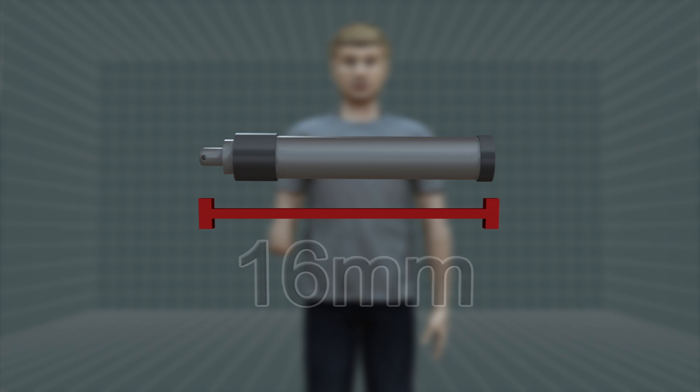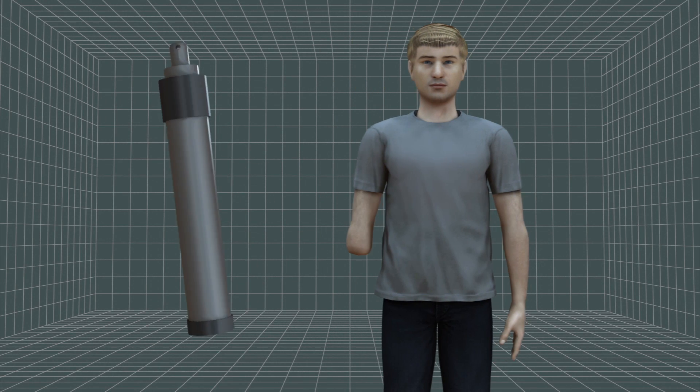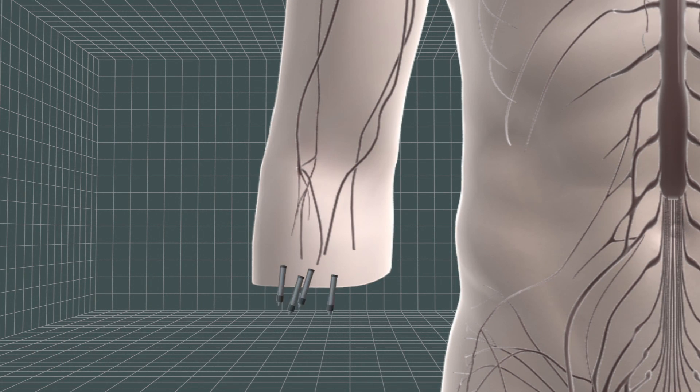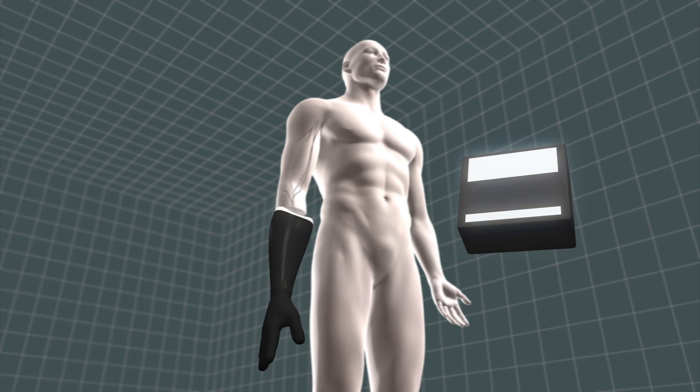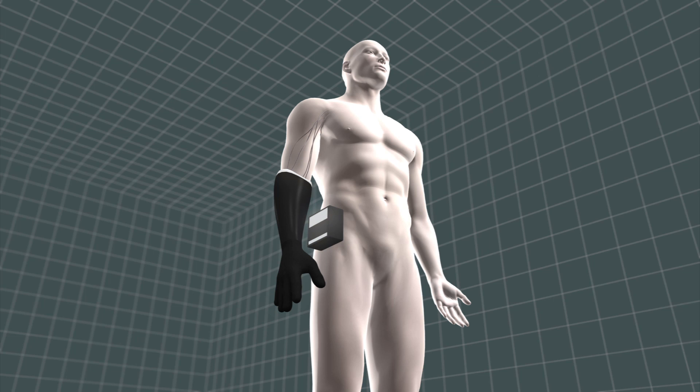Tiny wireless sensors about 16mm long are embedded directly into the residual muscles of the amputee's limb. They detect the signals that travel from the brain to the muscles and control specific movements.